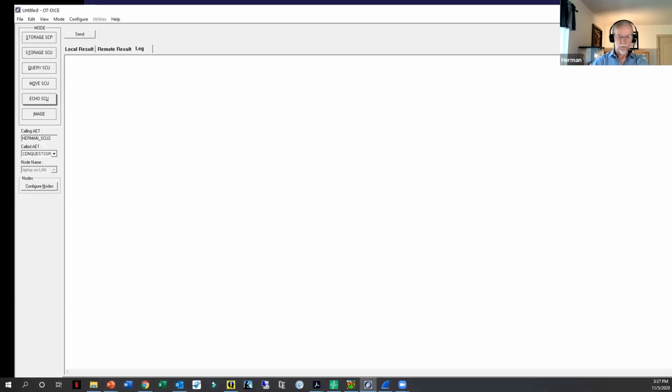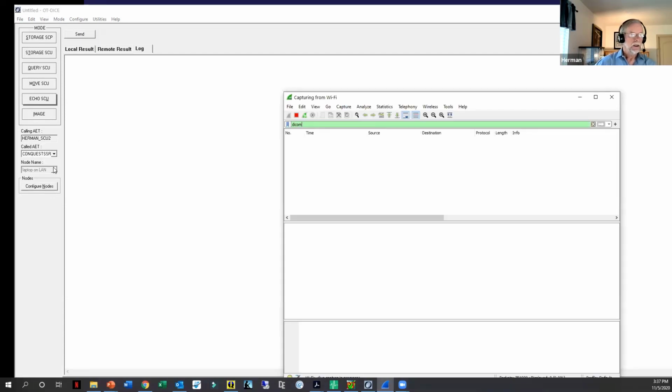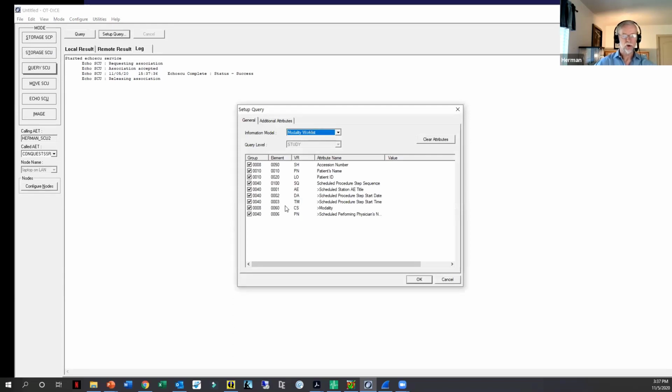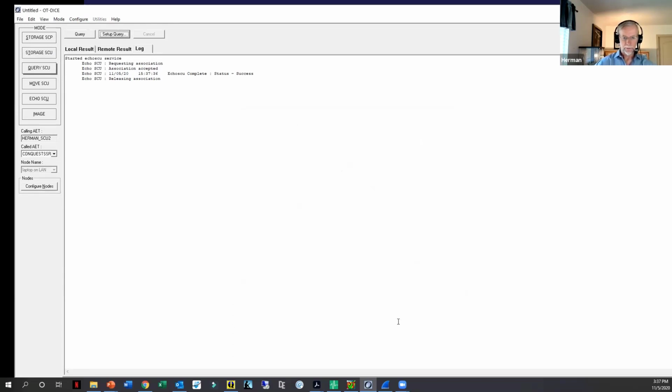Right, and in the meantime, I'm going to use my packet sniffer to look at the communication. So on laptop, on LAN, I do an echo send. And then afterward, I do a query, set up my query. I can set up whatever I want to query on. Okay. Execute my query. It worked.